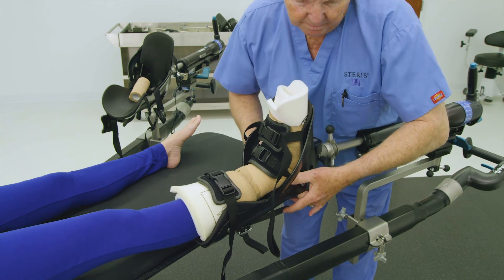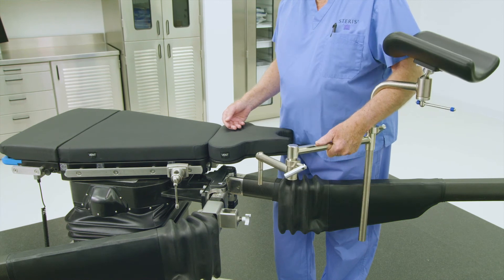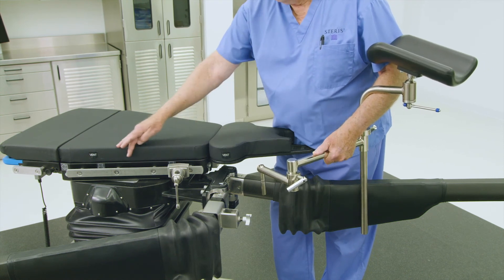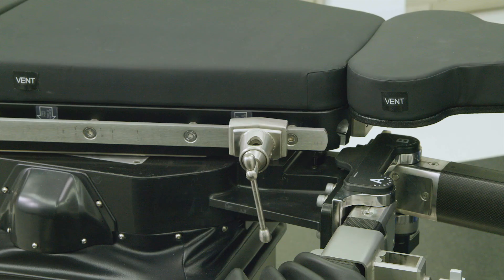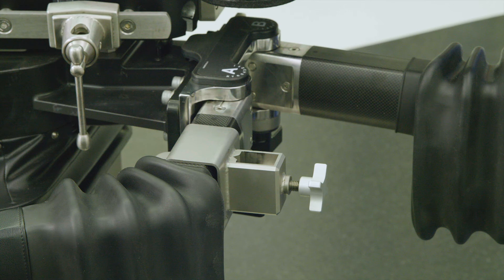A universal leg holder will be used for the other leg in unilateral situations. Most unilateral orthopedic cases will employ the use of a universal leg holder to position the non-operative leg during surgery. A socket clamp for the side rail or a spar clamp can be used for accurate positioning. Place the socket clamp on the tabletop side rail on the non-operative side. Alternatively, place the spar clamp on the short section of the spar on the non-operative side and tighten down the handle to secure.